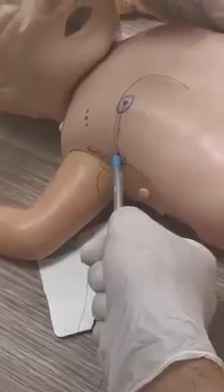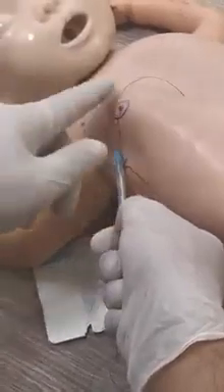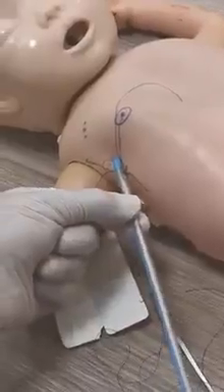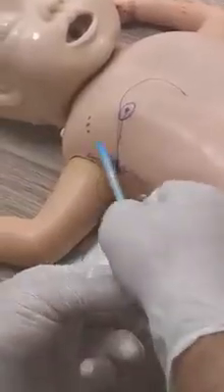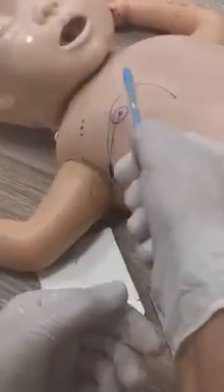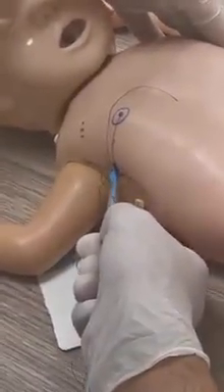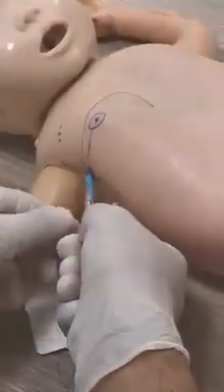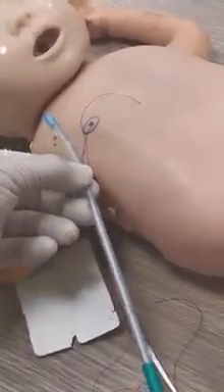So we need to make a support from the other side. Then you will go like this. Then you will press. Once you pass, I'm going in the direction here, and I will never hold it from here or from here, because if I hold it from here, I will definitely go deep. So whatever I measure, I am holding the tube like this. I make support from the other side and I go from the side of insertion with a little pressure. Then I will find that I am in the space. After I am in the space, I will remove the trocar.